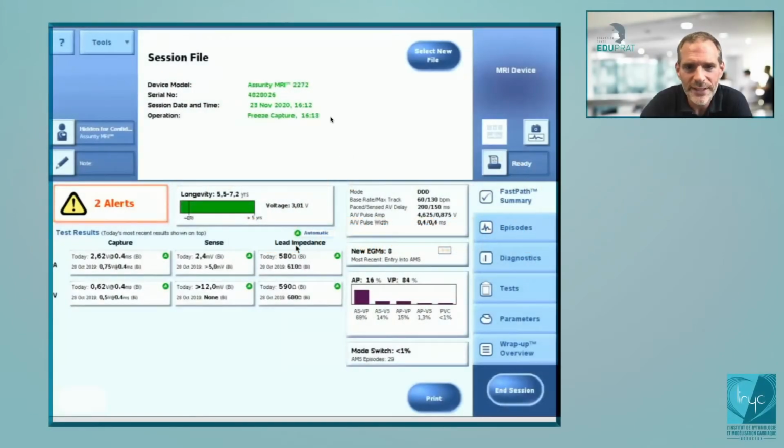Good morning, everybody. Welcome. Today, we're going to discuss how to interrogate an Abbott dual chamber pacemaker. And we're going to see the different steps, according to me, on how to interrogate a pacemaker.